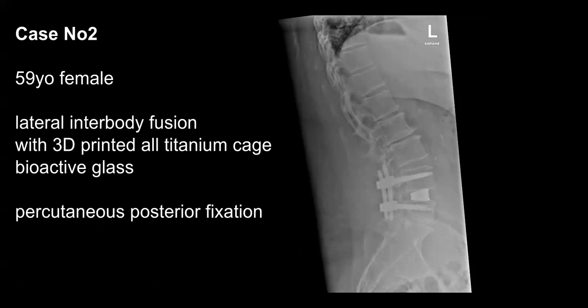In prone lateral, you can get a burr and easily decorticate those facet joints and pack them with graft at the same time as you're putting in your MIS screws. So it just adds an extra bony area for fusion. Yeah, I think this extra area for bony fusion is really good.